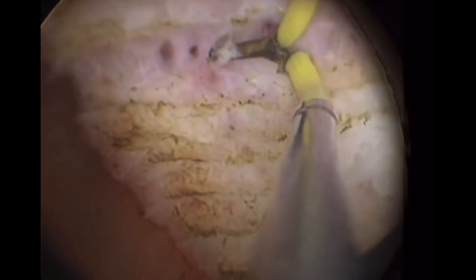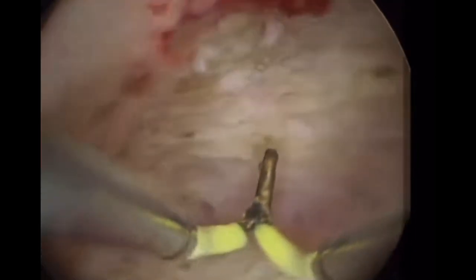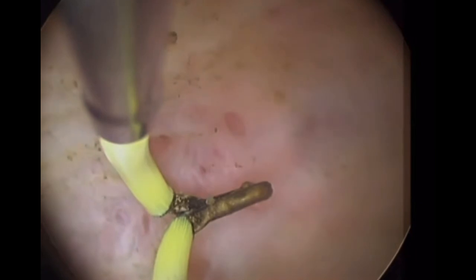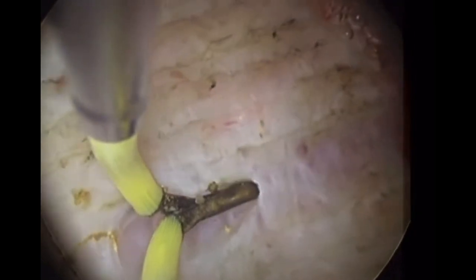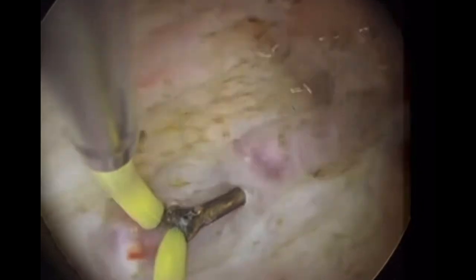You just touch and move. You will see these are muscle fibers — it's muscle and a little fibrous tissue. Take the tubal ostium as your GPS level. Unless you maintain a view to the tubal ostium, you might go too far up or down and then perforate. If you encounter some bleeders, don't panic — this bleeding is not serious. We need to coagulate to avoid a bloody view, since blood mixes with fluid and impairs visibility. Move the electrode from side to side with a very steady hand, millimeter-by-millimeter adjustment — sometimes two millimeters up, two millimeters down — observing fiber retraction and readjusting your level of cut.